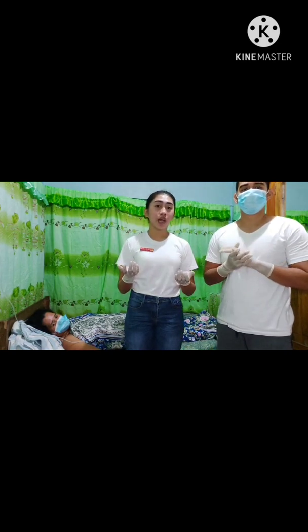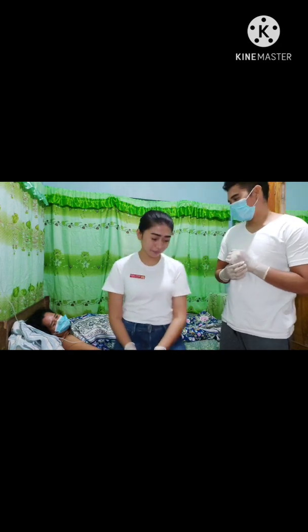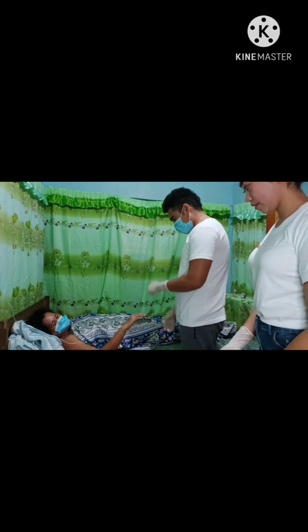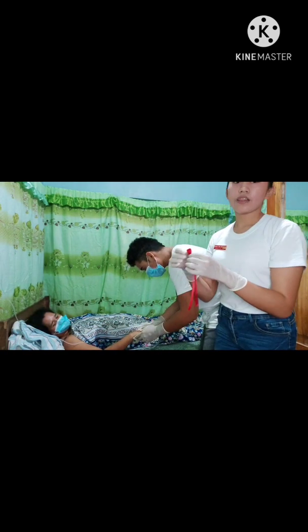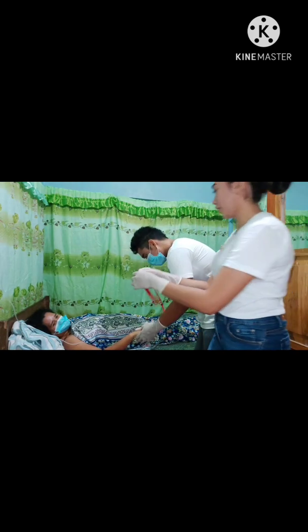So after putting our clean gloves on, the doctor will now locate the vein. Excuse me, ma'am. Can you extend your arm and make a fist like this so that I can scan your veins? When the doctor is scanning the vein, the assisting nurse should prepare a tourniquet and give it to the doctor.